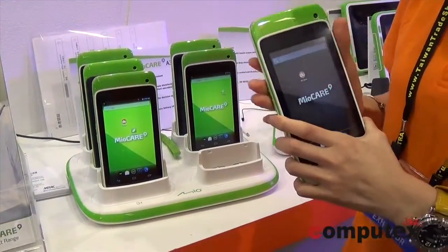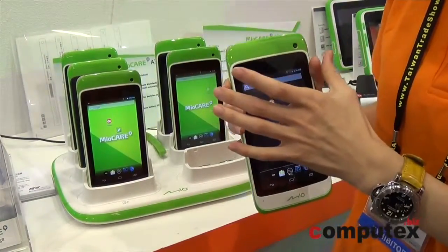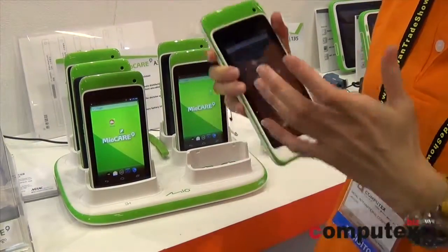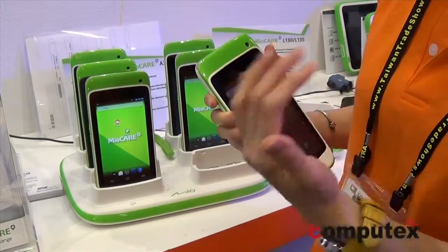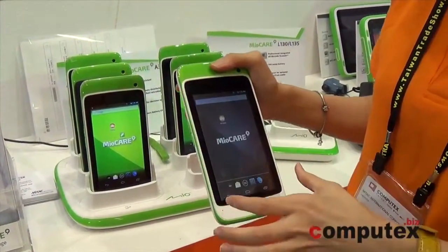We have GPS and NFC designed inside, and also Wi-Fi and Bluetooth. So you can transfer every piece of data or information to your data center, or pull information from your data center. This is a 5.88-inch screen.